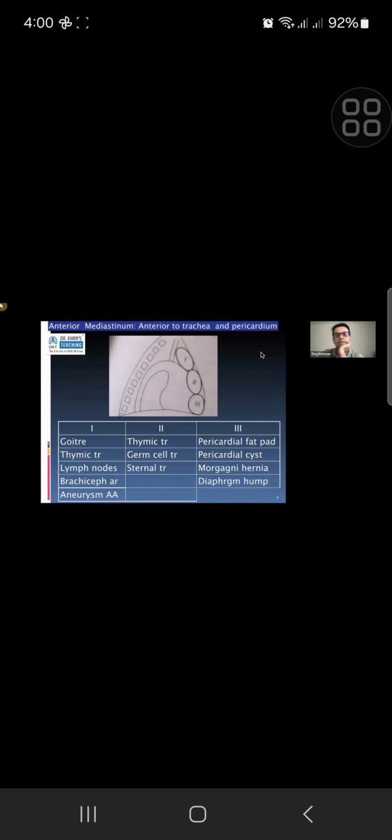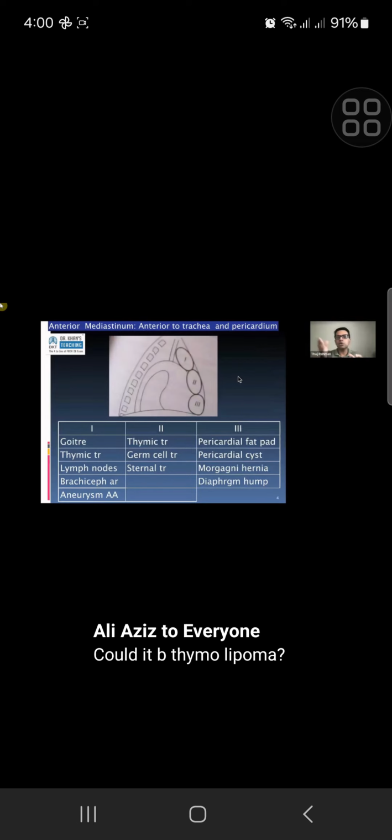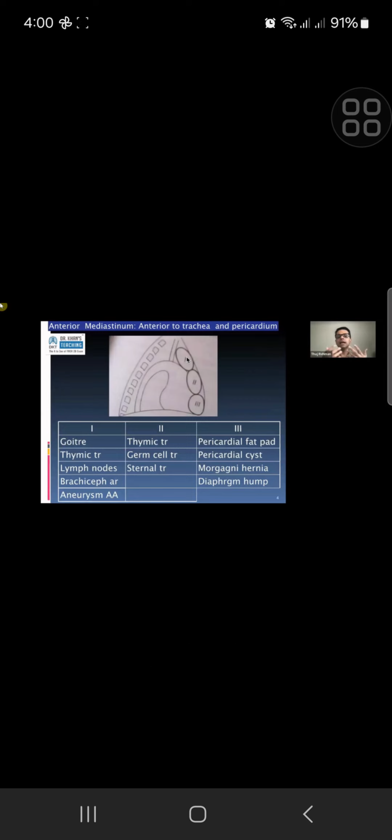So this is just taken from Chapman, and this is a really useful slide, not just for the exam, but for the rest of your lives. Arbitrarily, again, the mediastinum is just the space between the lungs. Nobody has put compartments in it; it is just arbitrary spaces. This is one continuous space. Chapman is dividing it into 3 for the ease of differential diagnosis.